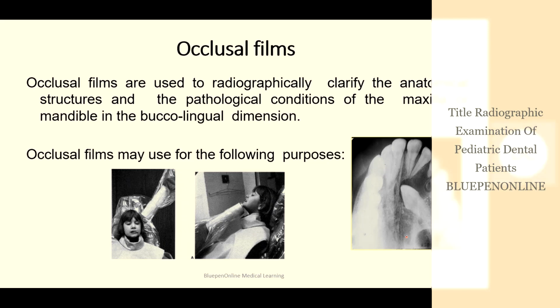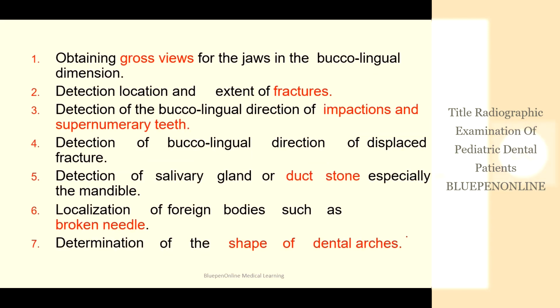various purposes like to obtain gross views of the jaws in the buccolingual dimension, for detection and location and extent of fractures, detection of buccolingual direction of impactions and supernumerary teeth, detection of buccolingual direction of displaced fracture, and for detection of salivary gland duct stone and localization of foreign bodies and determination of the shape of dental arches.